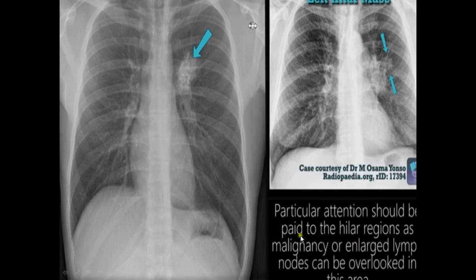Comparing the right hilum with the left hilum: the right hilum shows a normal concave orientation or configuration. On the other side, it is convex with somewhat spiculated margins. These findings represent lymphadenopathy along with some tumor.